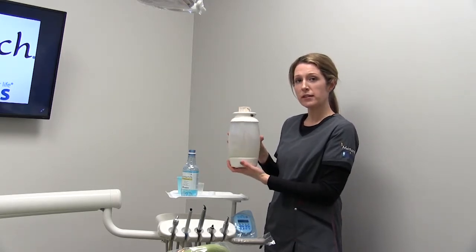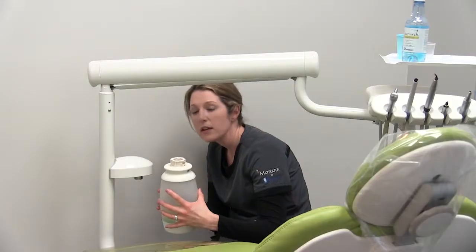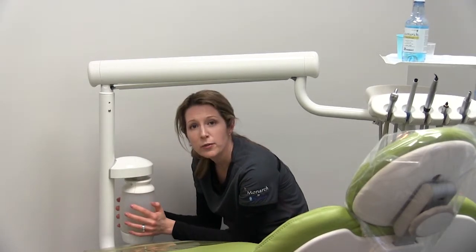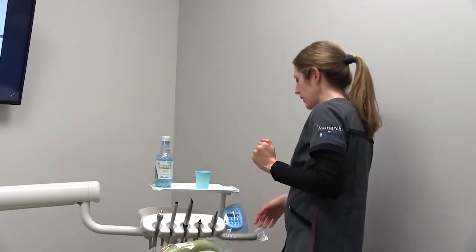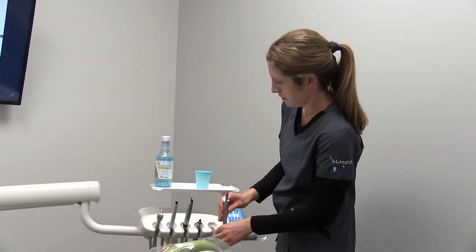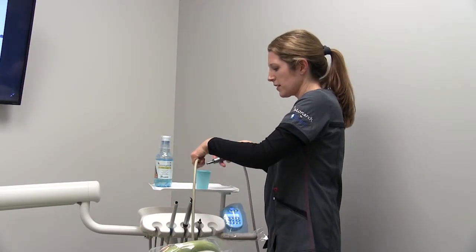Once you have the product inside, you're ready to put your bottle back on your unit. Securely fasten the bottle to the unit and now you're ready to run your high speed and your water. Go ahead and turn on your unit and run your water lines.